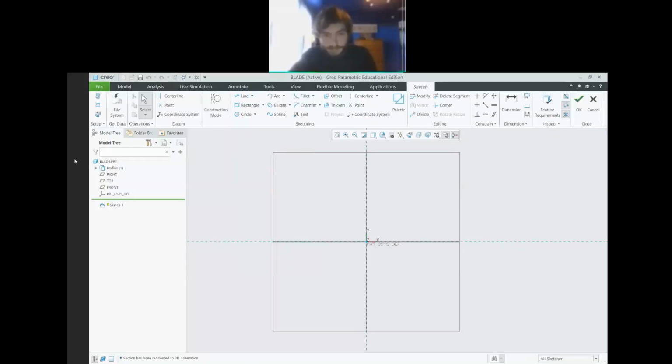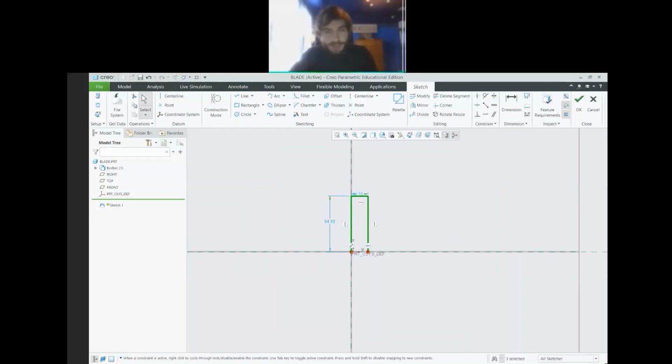Probably the easiest place to start is up at the top. It has a little bit of a straight piece near the top, so we can go ahead and create our U. Unfortunately, Creo is super annoying. If you create your whole sketch and then dimension something, it'll keep all of the fake dimensions it created. So the easiest way to get your scaling right is to draw some known line and then sketch stuff out later.